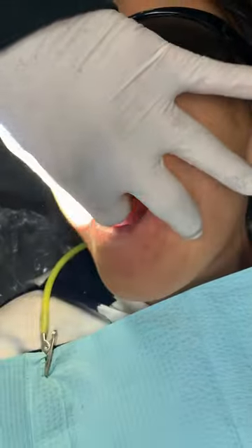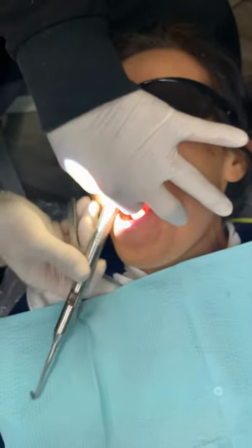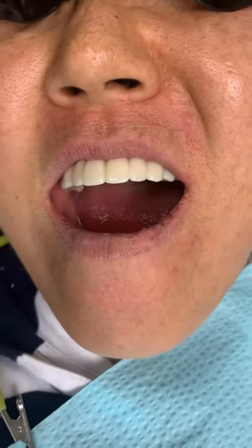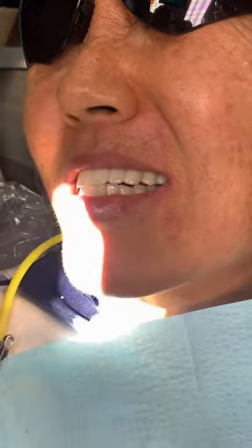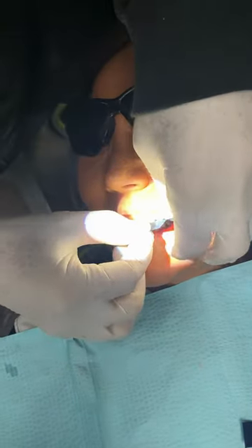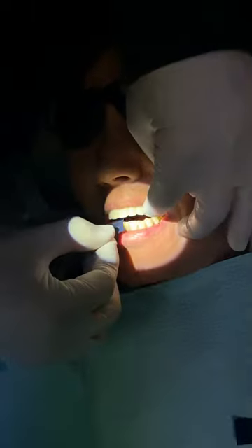That's the polish. Open. You're going to hear some loud noise. Bite down. Bite down. Open. Bite down.